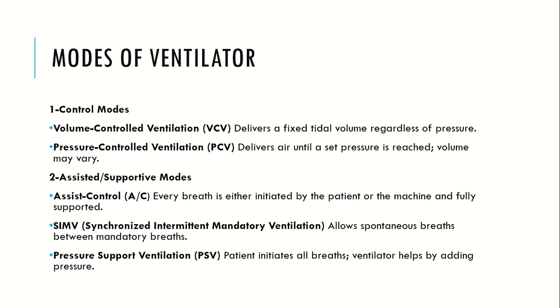The second one is assisted supportive modes. In AC, every breath is either initiated by the patient or the machine and fully supported. SIMV allows spontaneous breaths between mandatory breaths. And in PSV, the patient initiates all breaths, and the machine helps by adding pressure support.